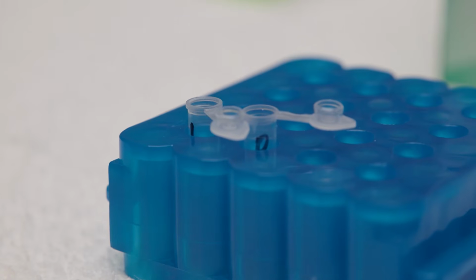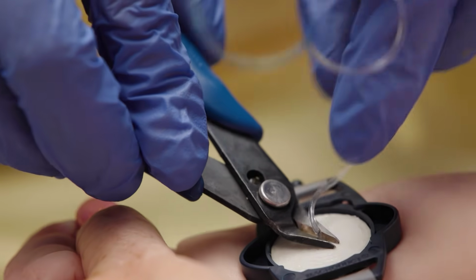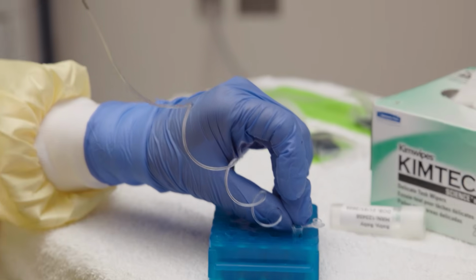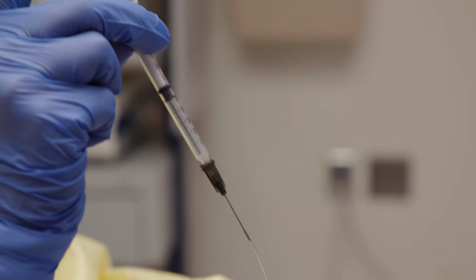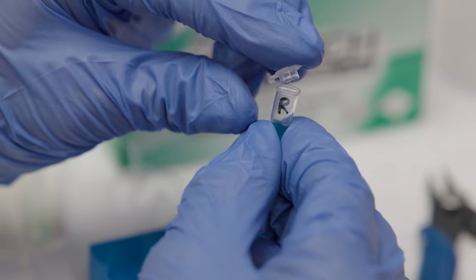Do not remove the collector from the patient before collecting the sweat specimen. A vacuum can draw the sweat from the tubing and reduce the specimen volume. Make sure the small collection tube is ready for transfer. Cut the tubing at the base and immediately move the coil to the microtube. Gently press the plunger to dispense the sweat into the microtube and secure the cap tightly.